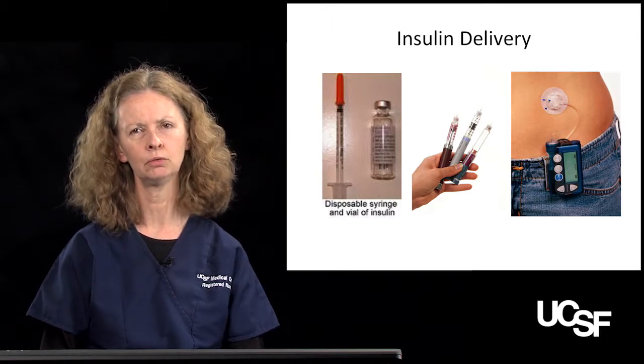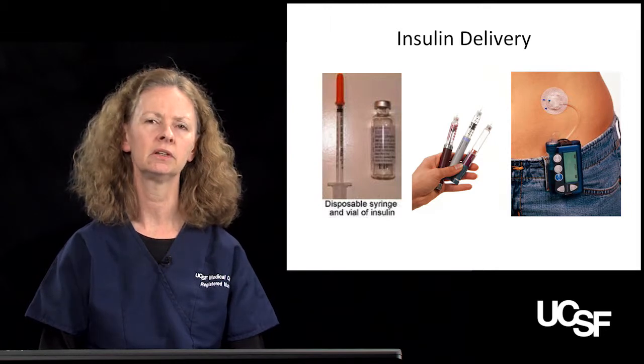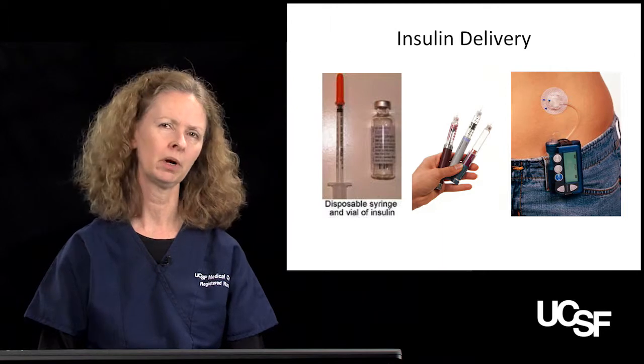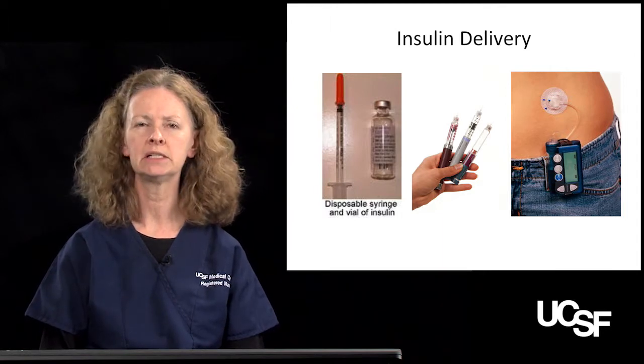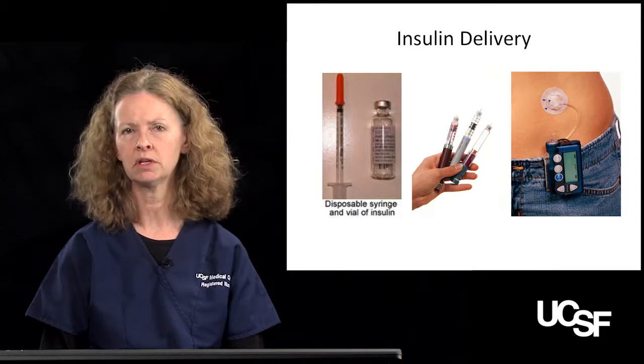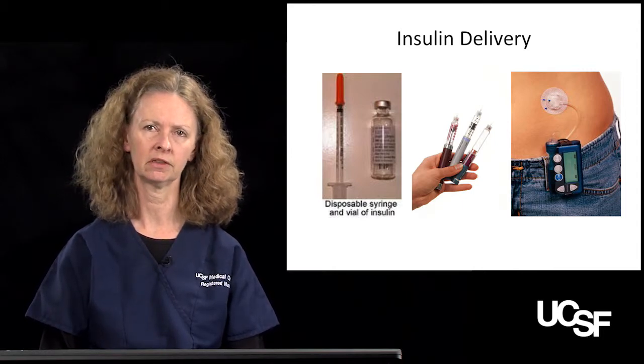So just to review, why would somebody develop ketones? It could be because the insulin's gone bad, it could be that there's a problem with their pump, or it could be that for some reason they maybe even just forgot to put their pump on. They had a shower, they disconnected, they left the house and forgot to connect their pump.